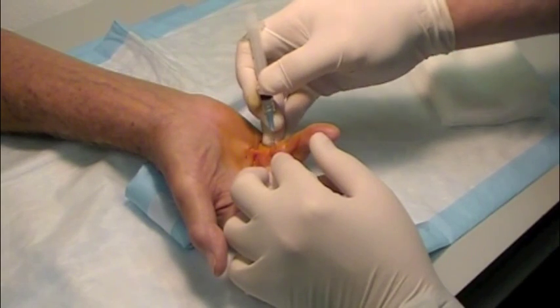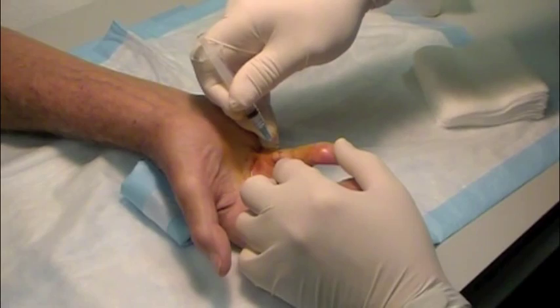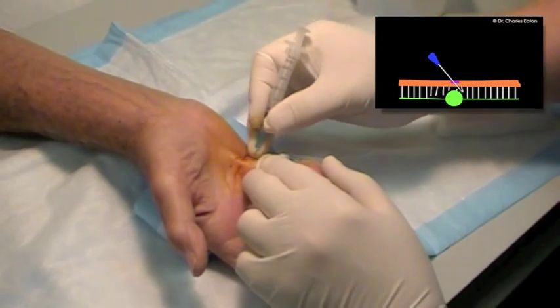Using a needle like a miniature scalpel, it is placed in several areas, dividing the cord into several segments, releasing the contracture and allowing the fingers to uncurl.